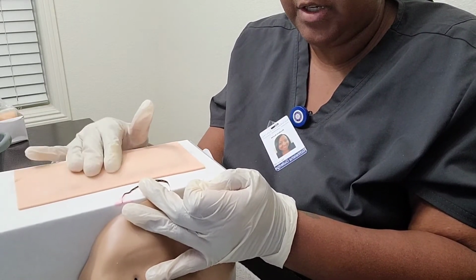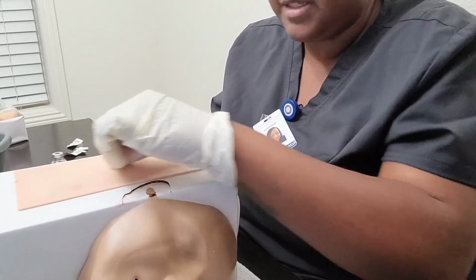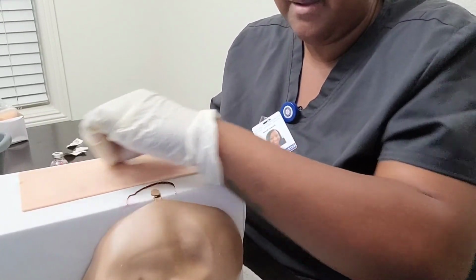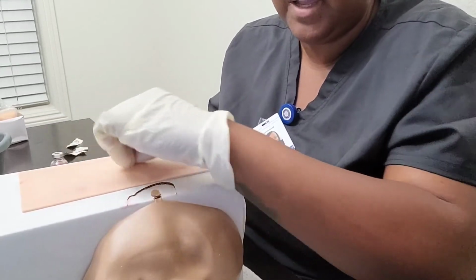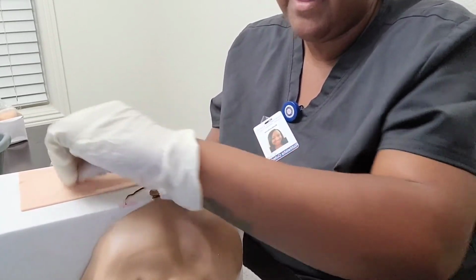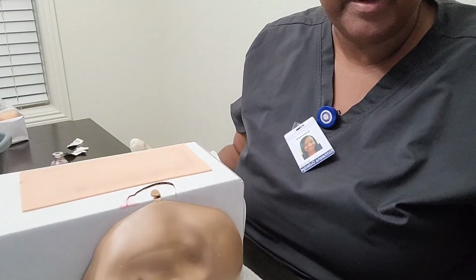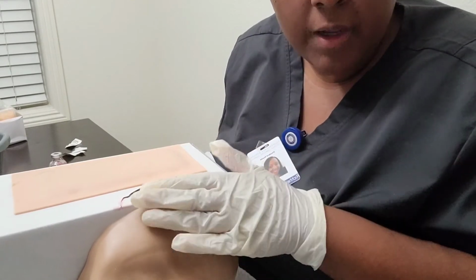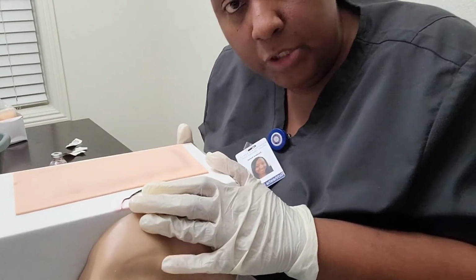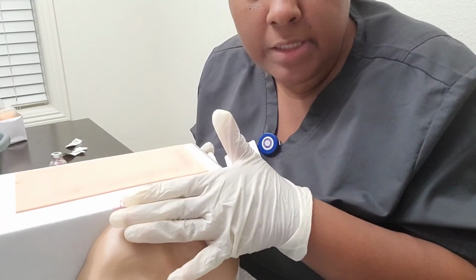Palpate for any tenderness, and then I will clean the site about 5 centimeters to 2 inches, going outer, and then I will allow this to dry on its own. Okay, so now I am ready to administer the injection. It has dried on its own.